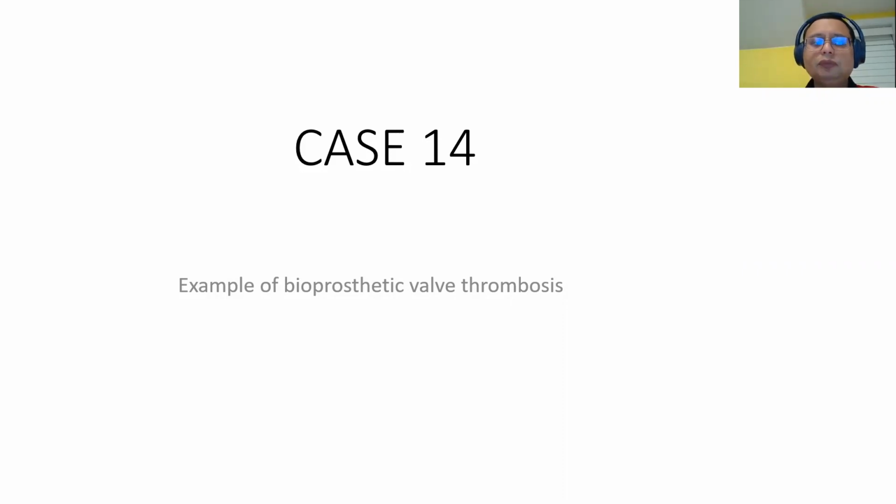And when you do a transesophageal echocardiogram, in my personal experience, about 70 to 80% of the time, you can tell from TEE whether you're dealing with thrombus or calcification, structural valve degeneration.